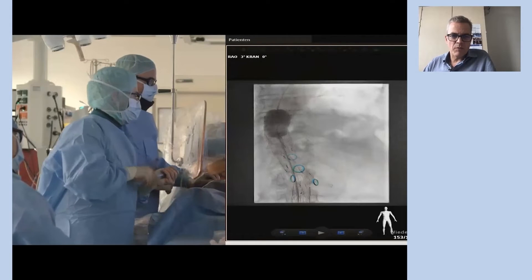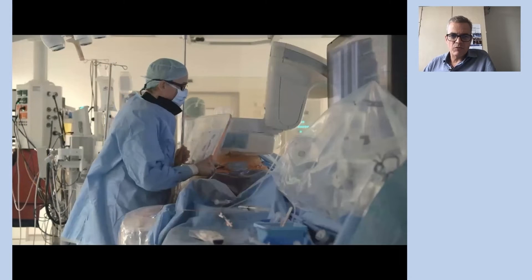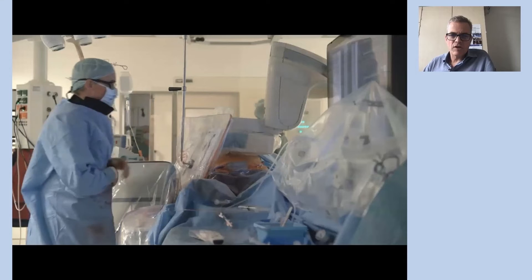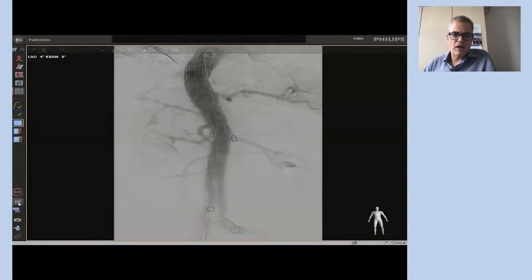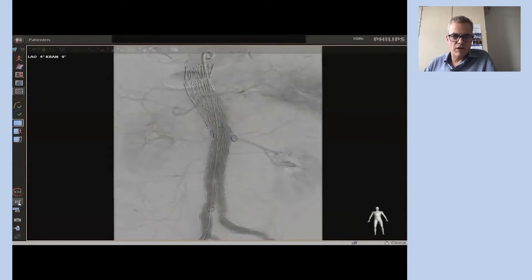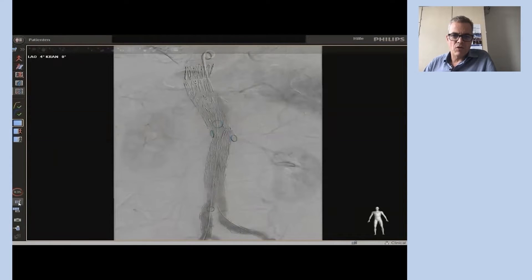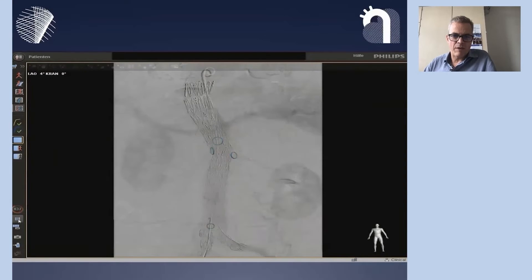Ballooning is still an important step of these procedures, and the final angiography shows unimpeded flow to all the target vessels and no more than some type 2 endoleak in this procedure.